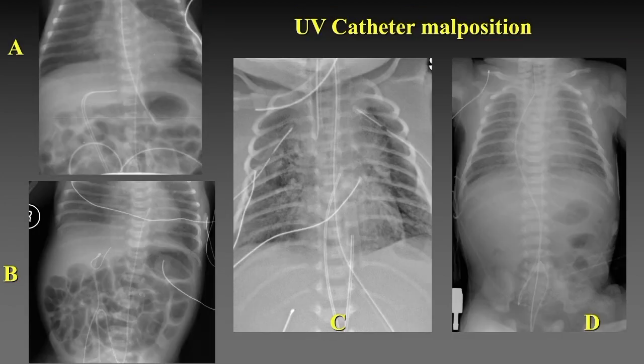Here are four examples of UV catheter malposition. Case A shows the UV catheter tip in the left portal vein. In case B, the catheter is coiled within the liver, probably at the junction of the ductus venosus and portal veins. Case C shows the UV catheter coursing into the right ventricle and entering the right ventricular outflow tract. Case D shows the UV catheter threaded up into the superior vena cava.